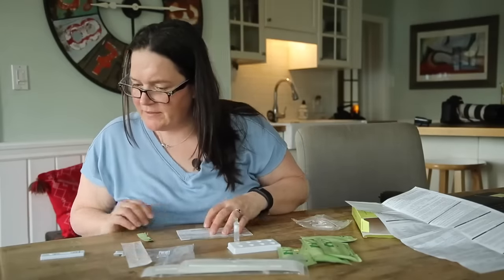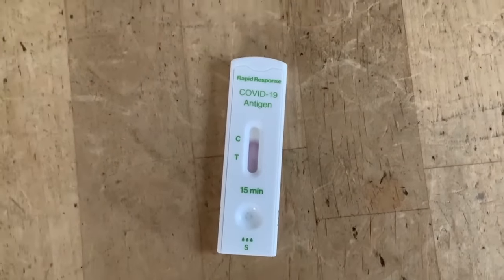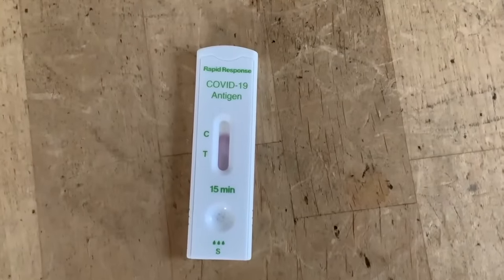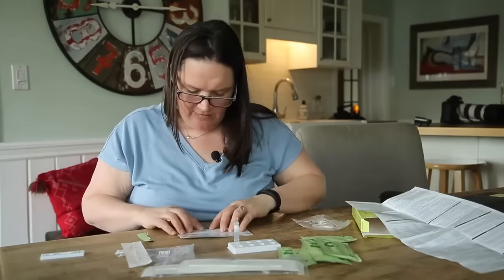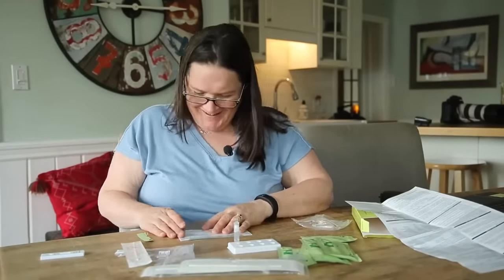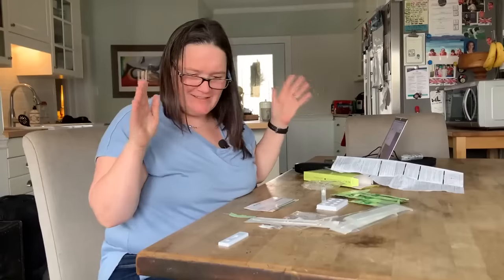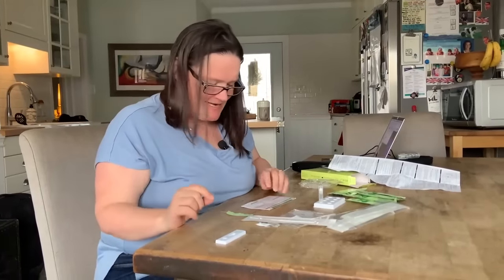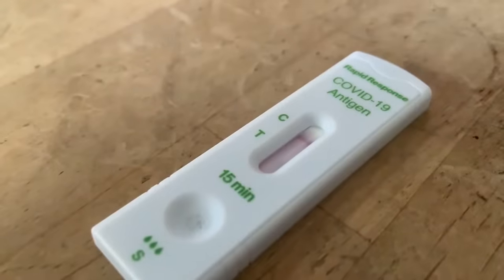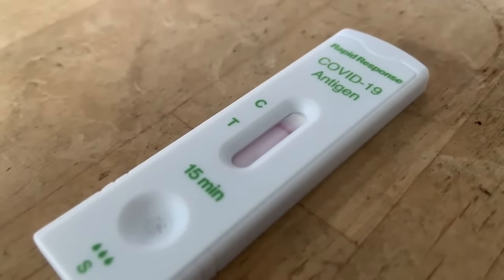Now we wait 15 minutes. You can see it's a bit like a pregnancy test — it's changing color as the solution moves up inside. If we get two red lines, then I've got COVID and we've got a problem. If we get one line on the C, that's what you want — it means your test is negative. And if you get only one line on the T, then your test hasn't worked properly. So let's wait 15 minutes.